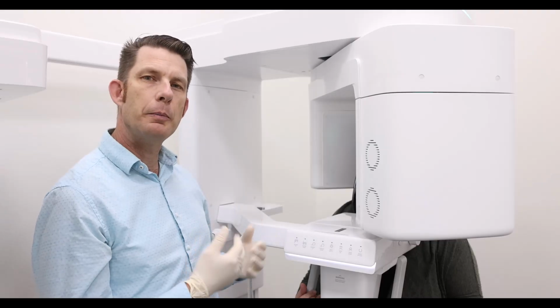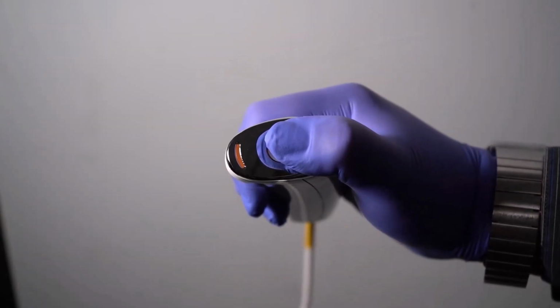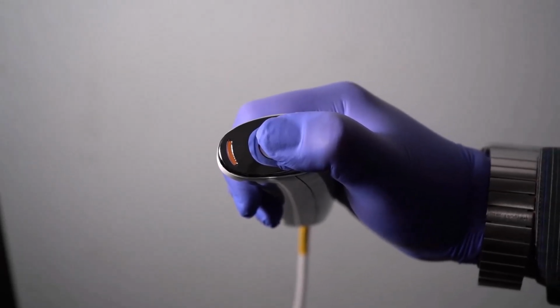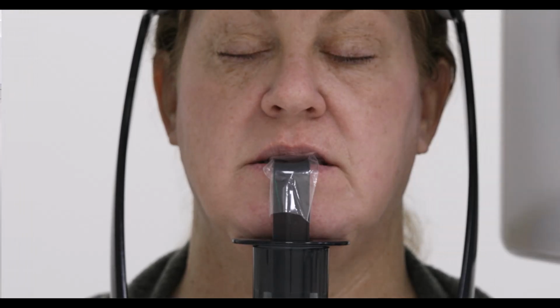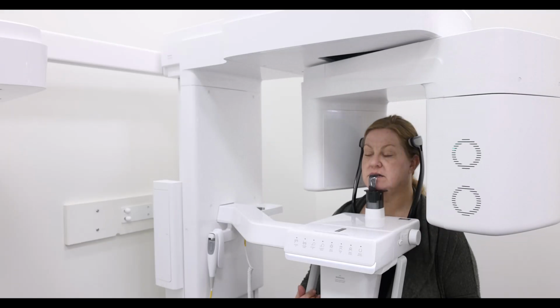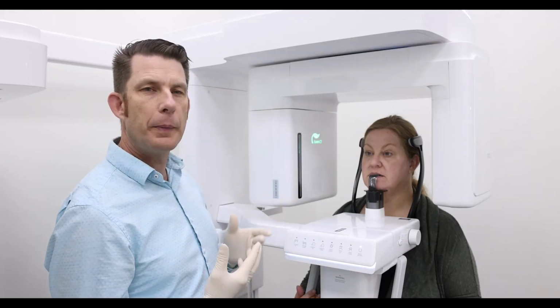Go ahead and step out of the room and capture our image. Hold the button on the acquisition trigger switch, which will turn yellow when exposing. Image capturing is complete. Please wait a moment. Once capture is complete, the device will have the patient open their eyes.